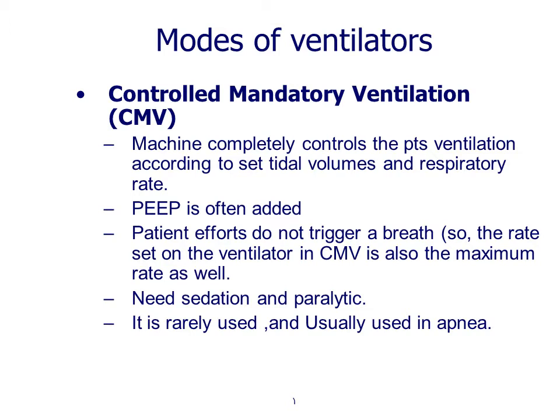The PEEP is often added, which is the positive end expiratory pressure that helps keep the alveoli open and prevent the alveolar collapse. Patient efforts do not trigger a breath, so the rate set on a ventilator in CMV is also the maximum rate as well. كونه المريض ما بيشارك بأي effort، إذا احنا بنحط للمريض على جهاز التنفس الاصطناعي الريسبيراتوري ريت الذي يحتاجها. Sedation needed, paralytic agent needed. It is rarely used and usually used in apnea بحالات توقف التنفس.